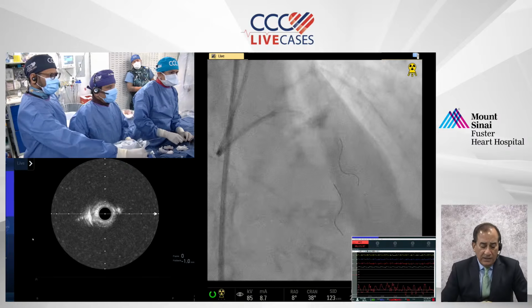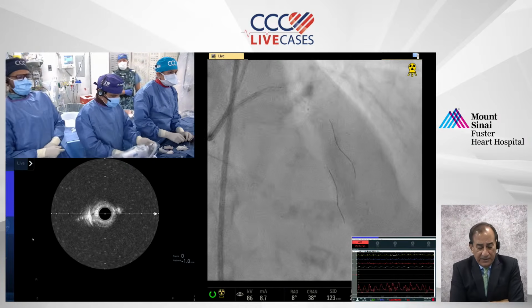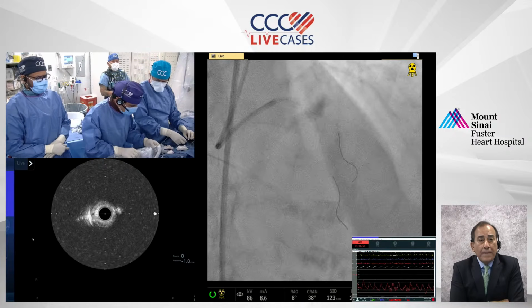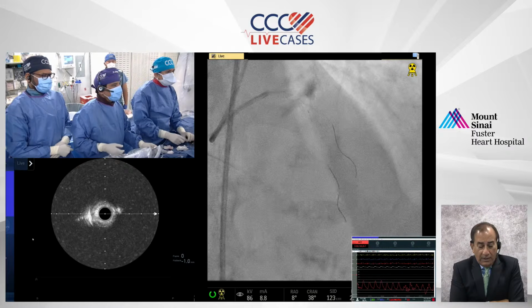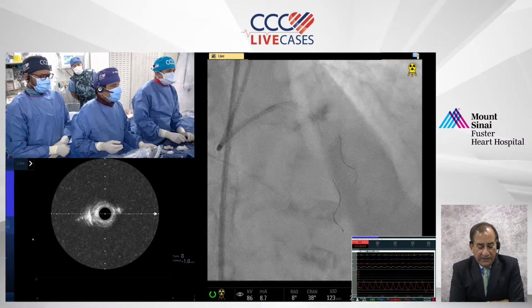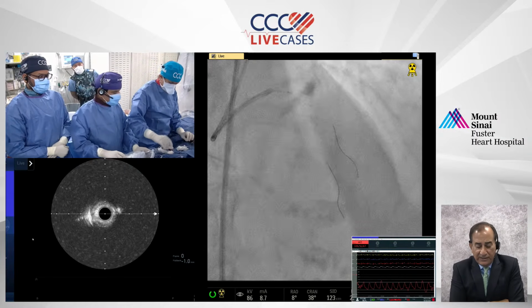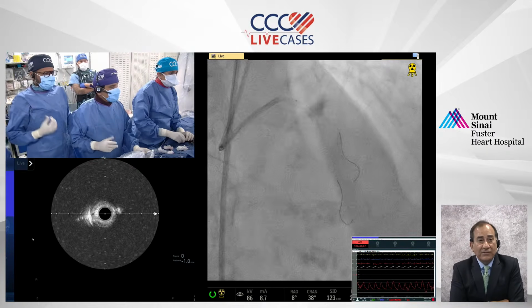Another lovely question coming again from Nikhil Jha: if there is simultaneous intimal calcium... You did not put it correctly. Nothing to do with that. Yeah, now go. That's good. No, it's not. Pull back and go in again. I'll repeat the question for you: if there is simultaneous intimal calcium and adventitial calcium, then how do you pick adventitial calcium on IVUS?